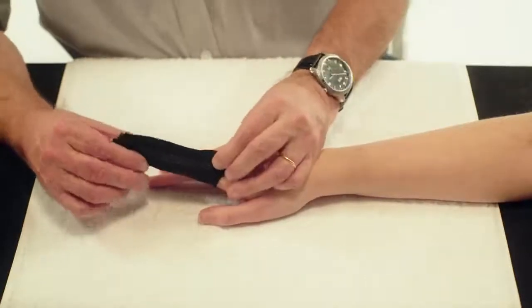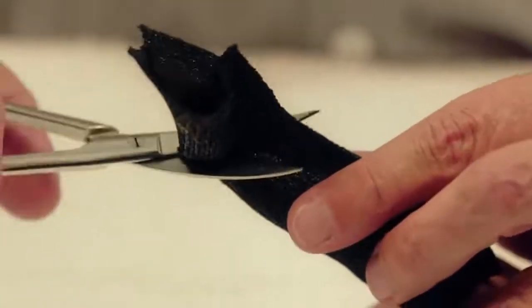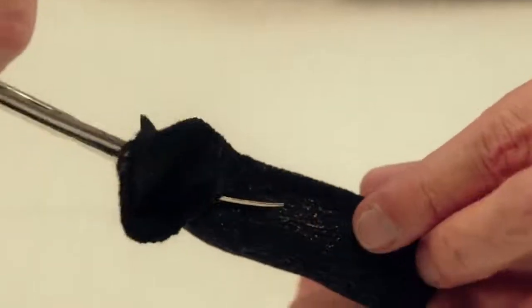Over the entire length of the finger, using curved scissors, pull and cut the excess material away, leaving a seam.